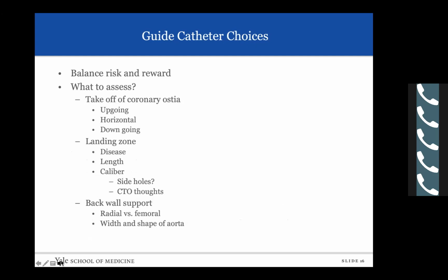There are guides with side holes. I am not particularly a big fan of side holes. There are other things you can do to de-risk your guide, to make sure you don't inject into an ostial stenosis or a narrowed vessel. But they do have some limiting effect on injections in terms of creating hydraulic dissection.